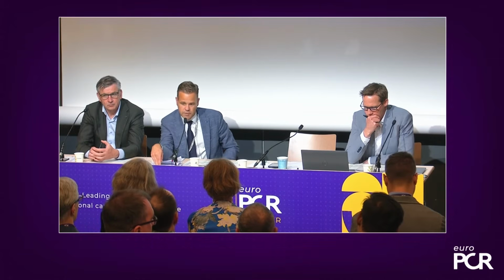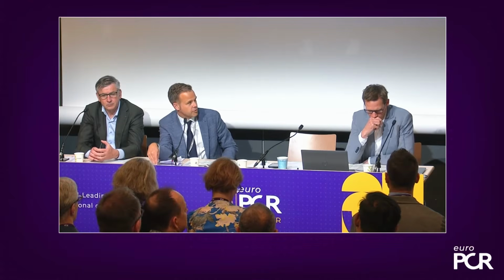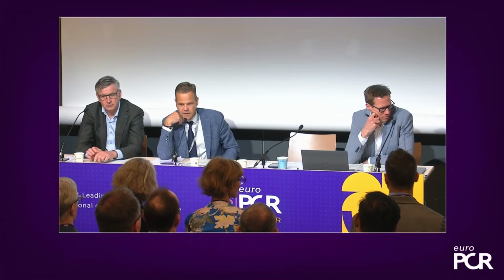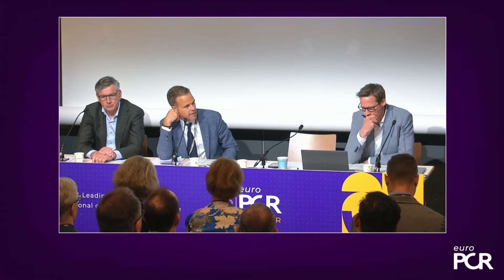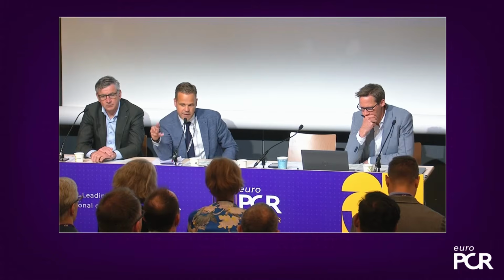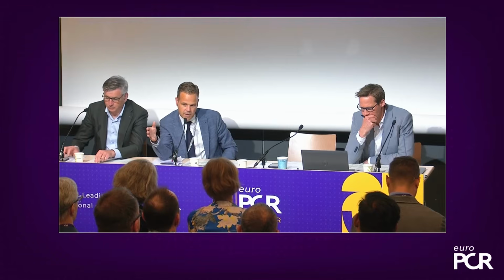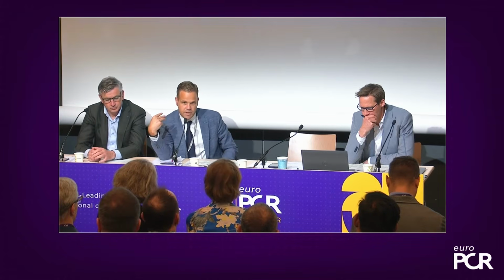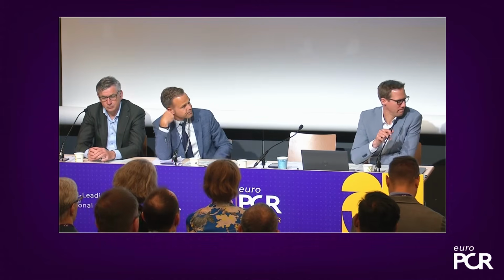Or they move forward towards ICE, and then frequently, because you want 3D imaging up front, they will do a CT to give you all the details up front. And I think it doesn't really matter which way you go, either way. But I think it's necessary. And the nice thing about these new technologies and the fusion is that you can take all the information you already got from the pre-procedural planning into the procedure itself and use it during the procedure.